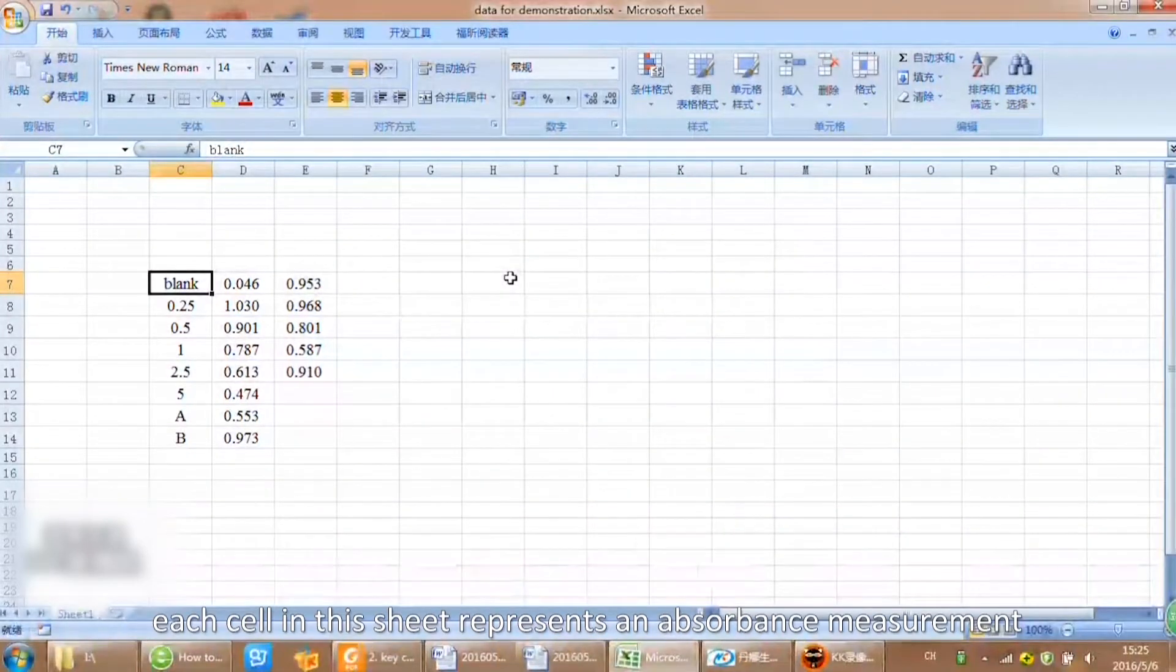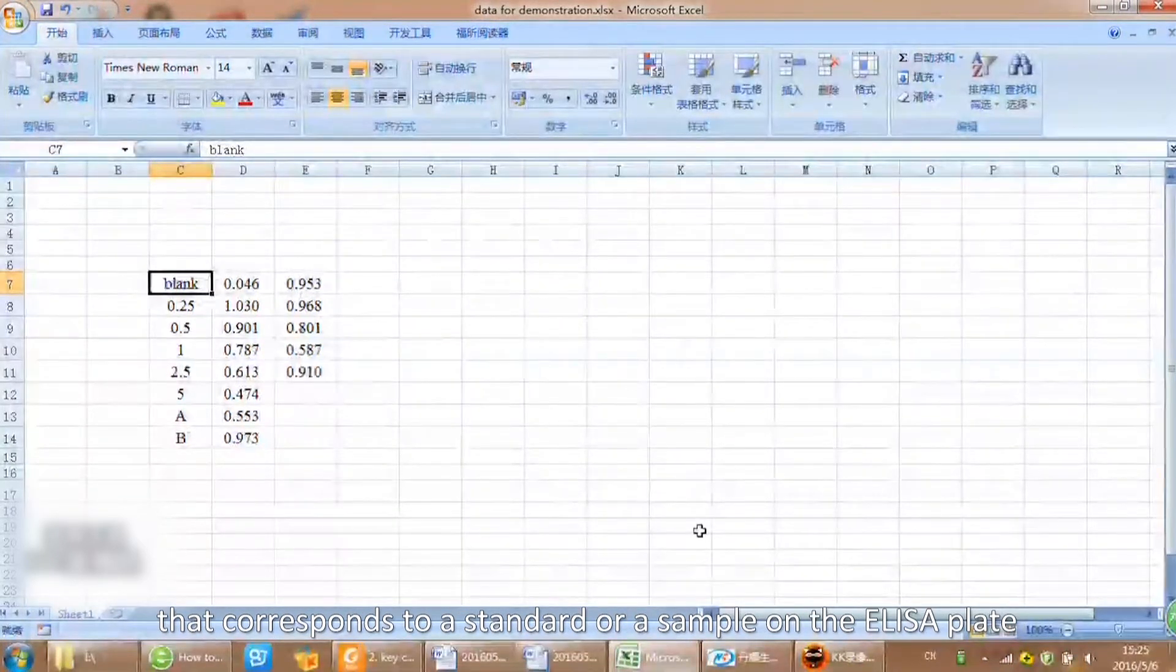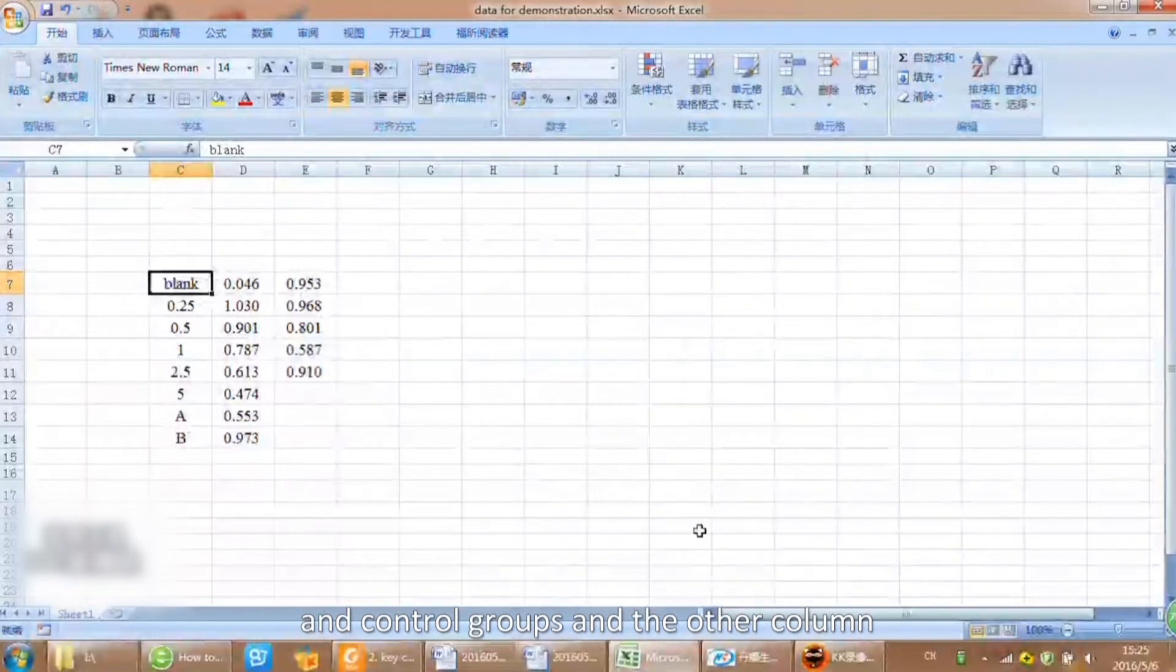Data analysis: As you can see here, each cell in this sheet represents an absorbance measurement that corresponds to a standard or sample on the ELISA plate. The first eight cells on the left column are the standard curve and control groups, and the other column is the absorbance of our samples.